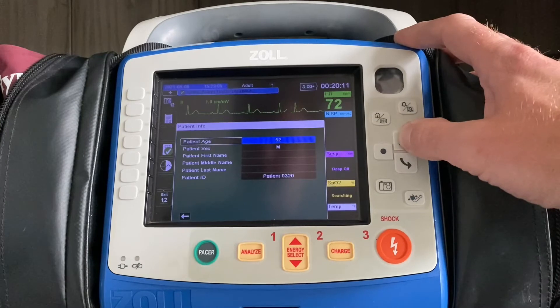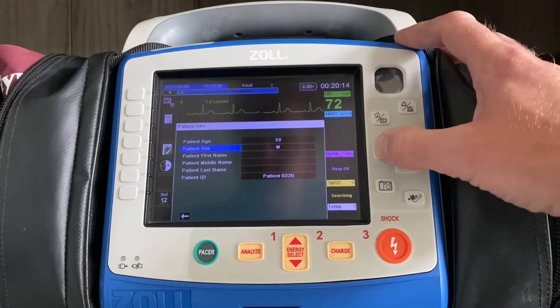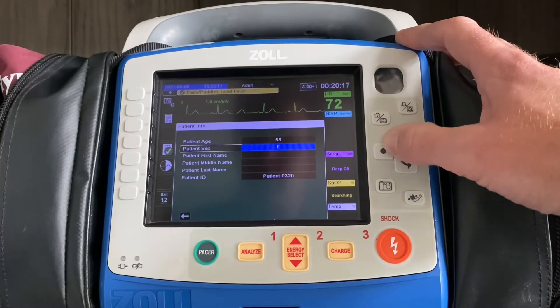If you want to adjust the age up or down, you can do so with the arrows. If it's a female, you go down, over, select female, and now you're good.